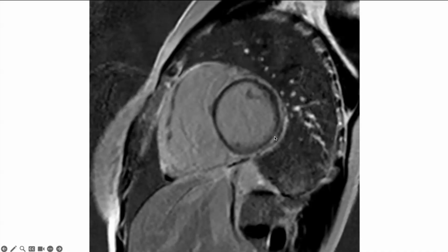I'll show you after. Yeah, it's okay. So some enhancement in the mid-myocardium, but the endocardium, which is all still black here, is not really affected.